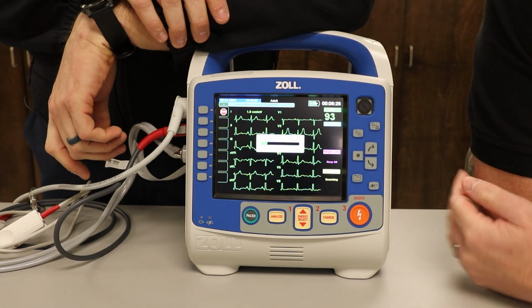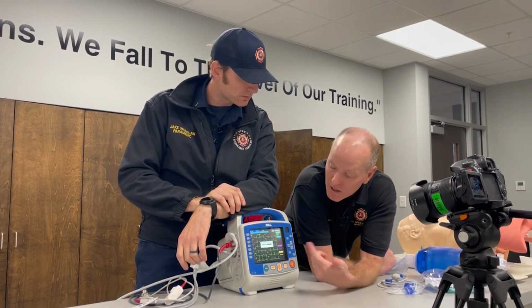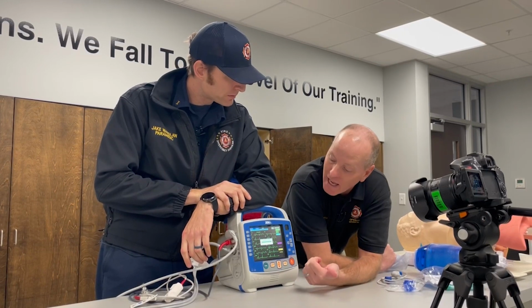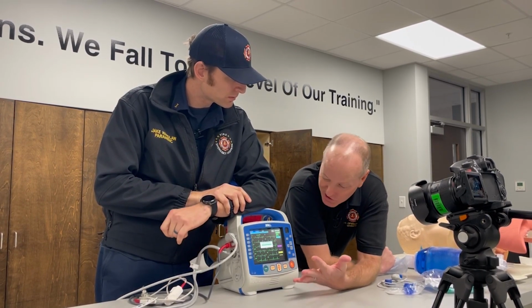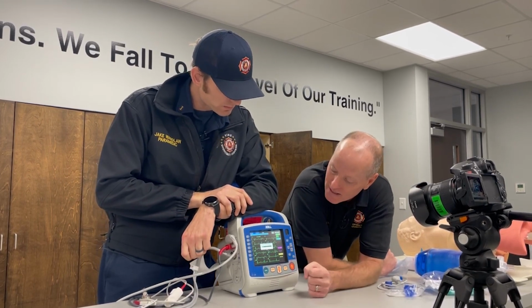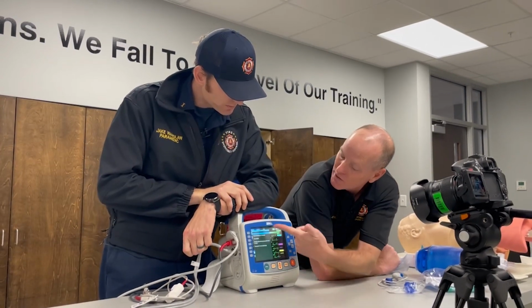The biggest thing here is remember, we're acquiring it. No patient movement. The Zoll is very, very forgiving on lead placements and some movements. Once again, that old 60 hertz stuff. As long as the patient's not vibrating too much, they'll actually do a nice clean shot. If you notice here, we actually have a nice clean one. So what does this screen tell us?